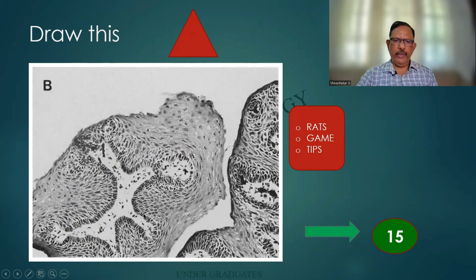So I would like you people to kindly draw this, the squamous papilloma. These are the sources of this particular one, and the reference I have also mentioned. We shall be going to slide number 15.